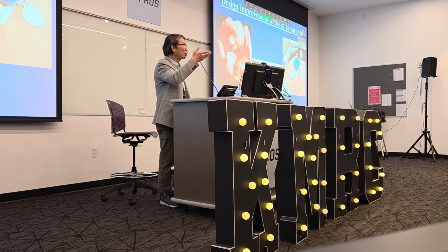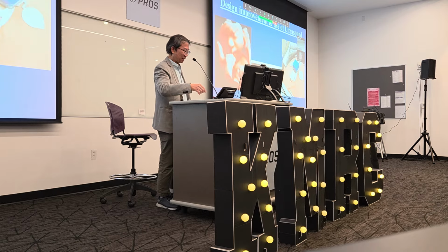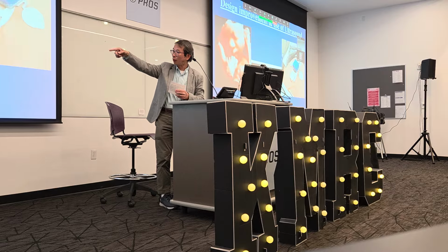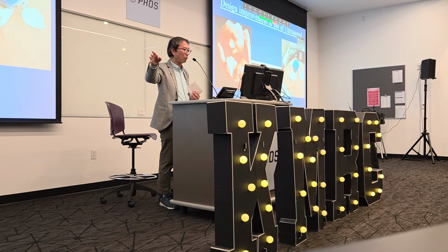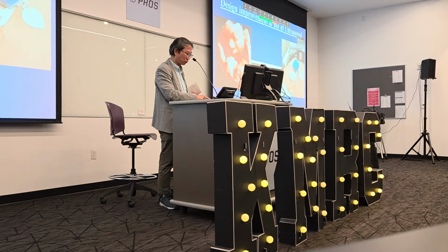Children here, the chance before you were born, most likely you have had an ultrasound exam. So today, because of the time, I will just show you the high level of the design improvement in ultrasound. You can see on the right or on your left is the 3D ultrasound, an improvement over the traditional 2D ultrasound. In the middle, you can see the cardiac image. And the right-hand side is fetal Doppler, which records the fetus condition so the doctor can monitor it.